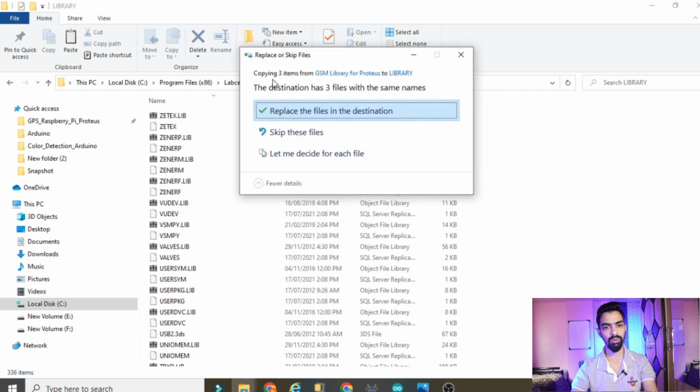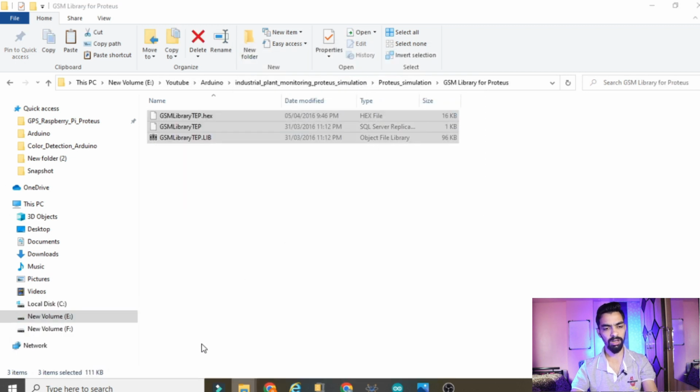I have already placed it so that it is showing this message at your end. It will copy and paste the GSM library here. In the same way you can install the Arduino library also.